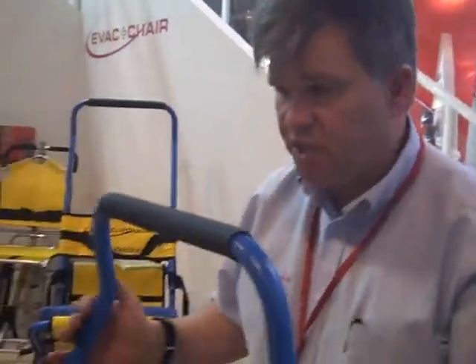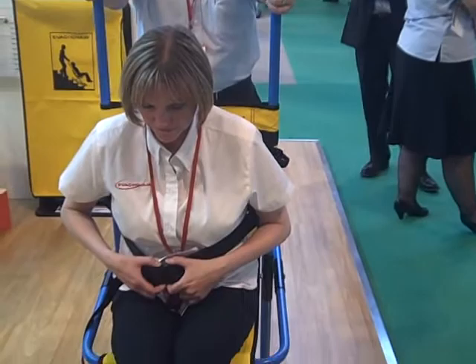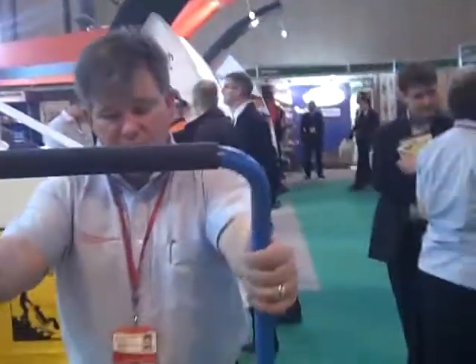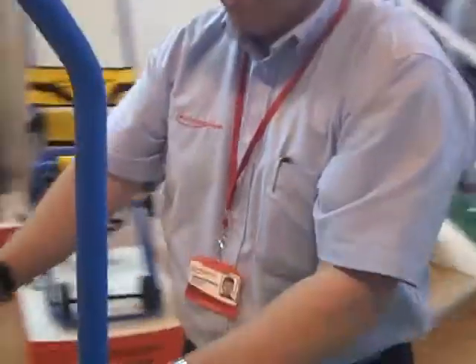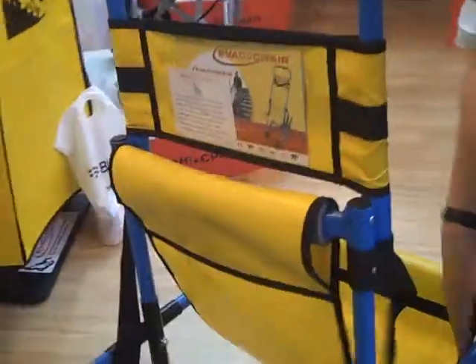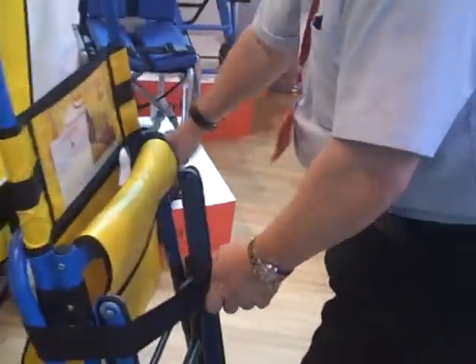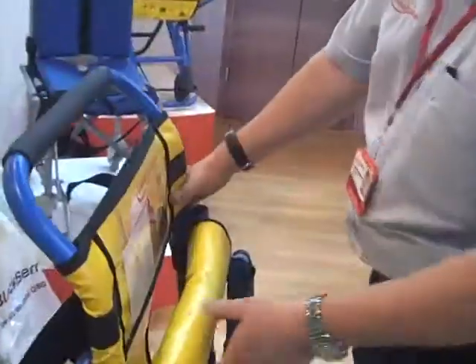I'm now going to ask Diane to get out of the chair. First of all, putting away the rear wheels and securing the chair to the floor fully. Thank you, Diane. Folding up the EVAC Chair is once again very simple. Just turn the chair, drop the straps inside the frame, lift up the seat, turn back, and secure the straps around the rear of the chair. It's all very nice and tidy and secure.